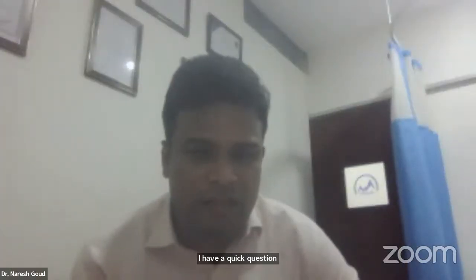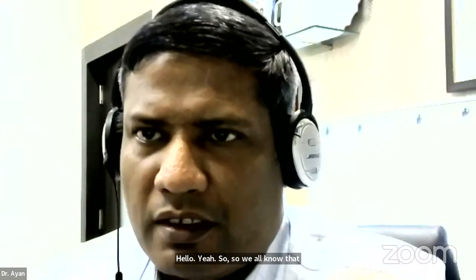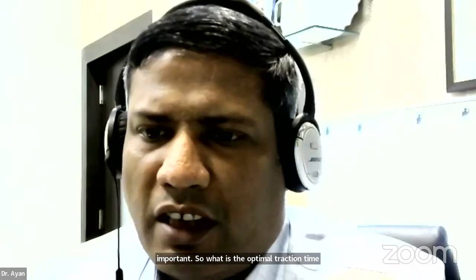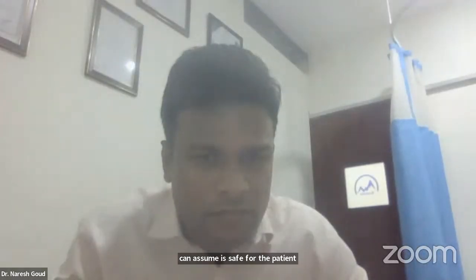I have a quick question. We all know that in hip arthroscopy the traction time turns out to be important. So what is the optimal traction time that we can assume is safe for a patient? Thank you for your question. We think the safe traction time is within 60 minutes.